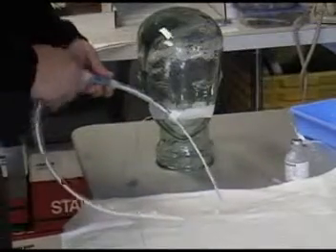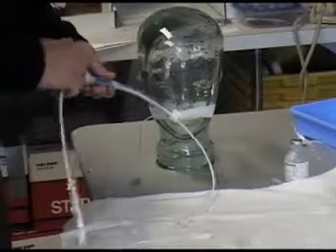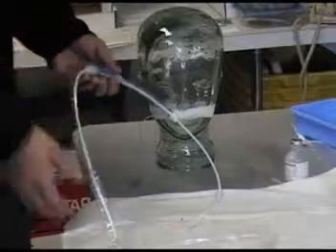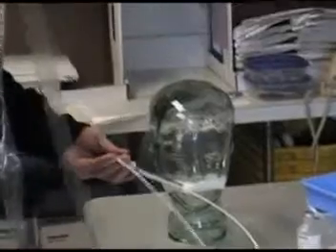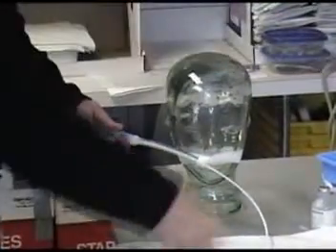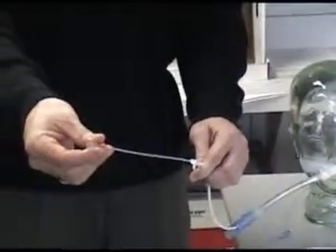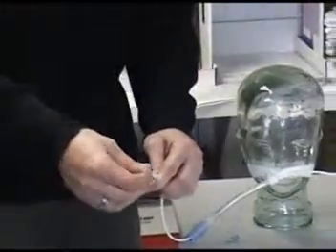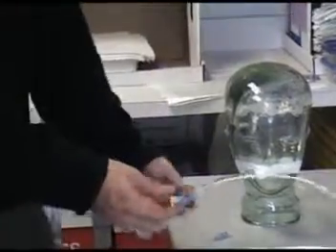When you get down there, feel this coming in, you'll feel resistance as you hit the lower lung. It's at that point you stop, as we talked about. You can then remove the sheath of this catheter. Be very careful when you take the sheath off. What happens sometimes is the Combicath, which is a dual lumen catheter, can actually remove the inner lumen of the catheter if you're aggressively taking that sheath off. So that's something that'll happen to you the first time and then maybe never happen again.